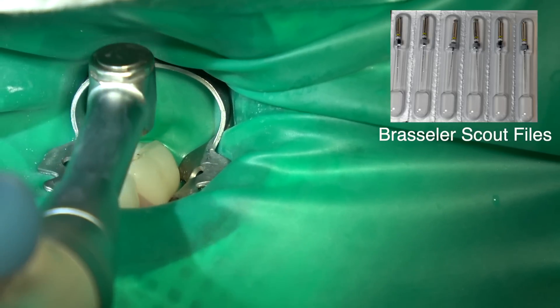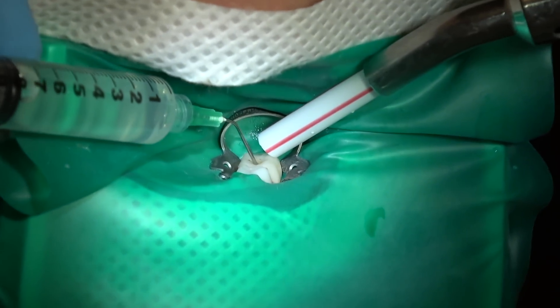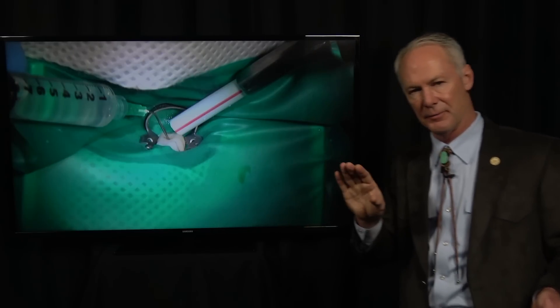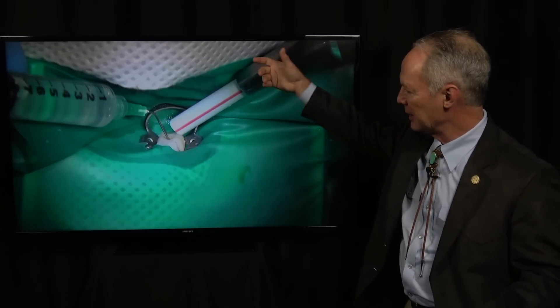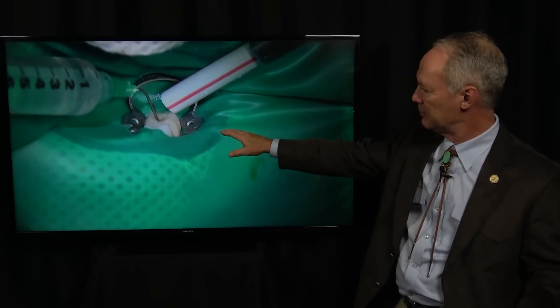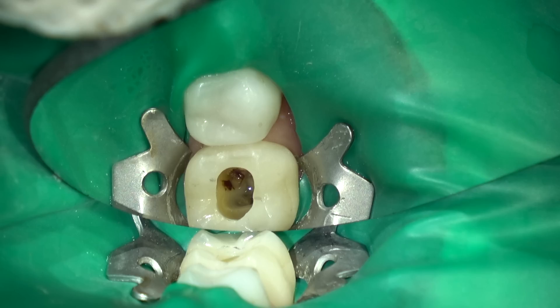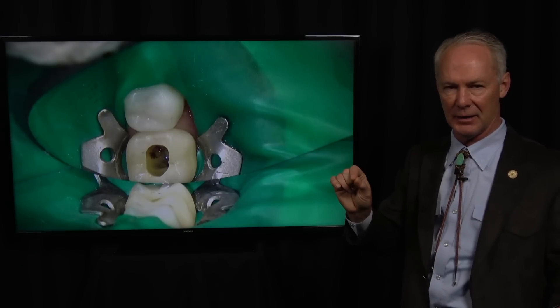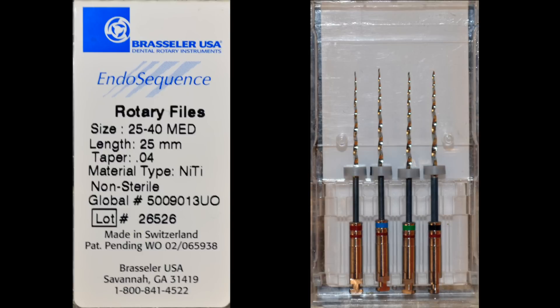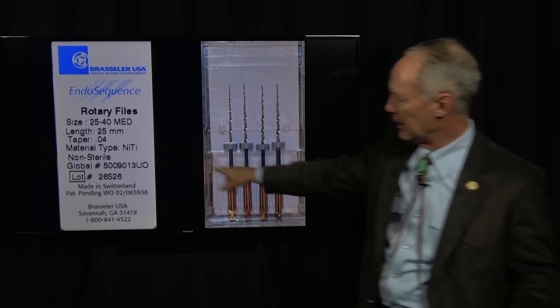You want to measure because we know it's about 22 millimeters. If you go out the apex just a little bit, that's okay. This is dilute sodium hypochlorite — three parts water, one part sodium hypochlorite. I'm not squirting it forcefully into the canal; I'm just filling up the pulp chamber and keeping the chamber filled with dilute sodium hypochlorite when using the drills or hand file — lots of lubrication. I file to depth with my K-type or Hedström, number 10 or 15, then come back with endosequence rotary files, number 25 to 40.